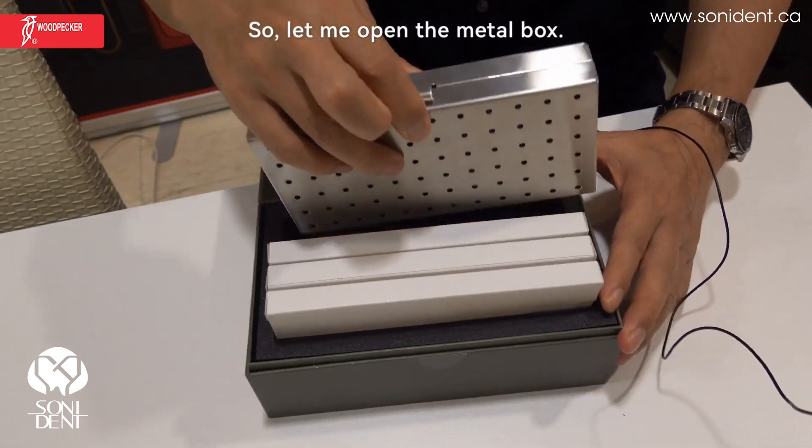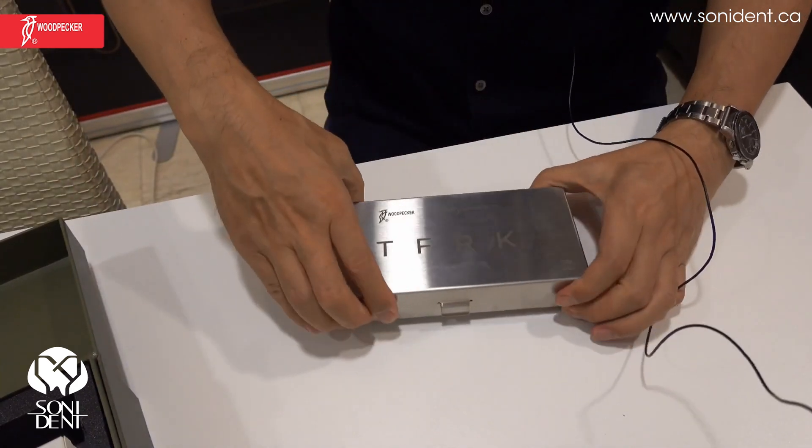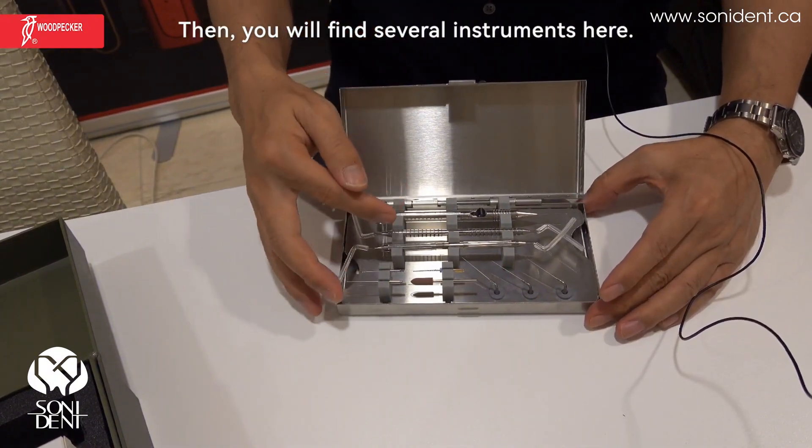Let me open the metal box — TFRK. You can open the box like this, and then you will find several instruments here.